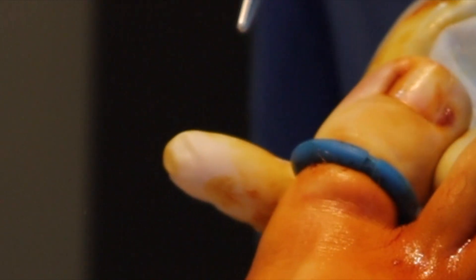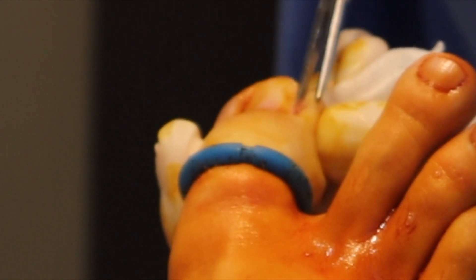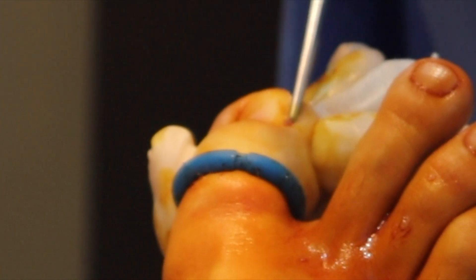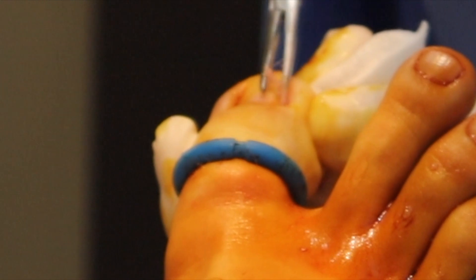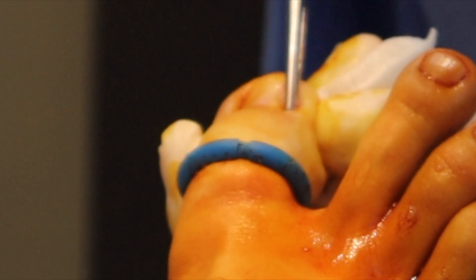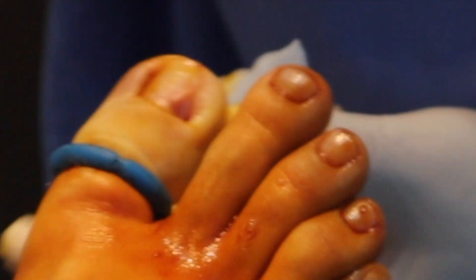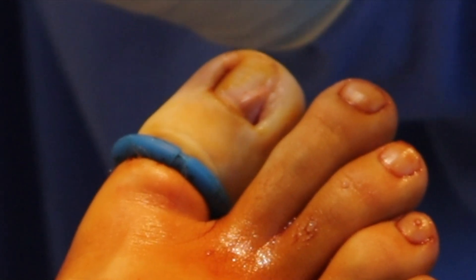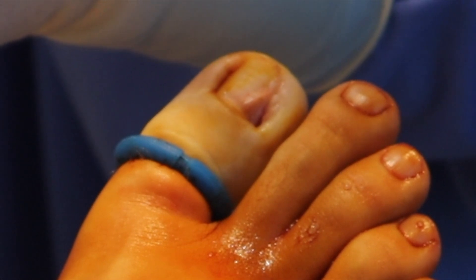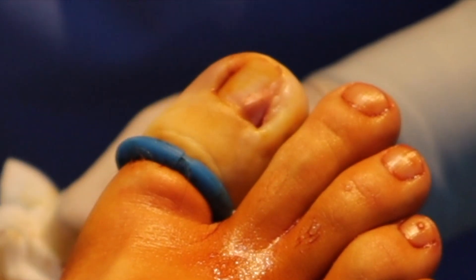Then I'm going to take a hemostat and get that piece out. Now we're not going to see a big piece today because I cut half of it away last week, so I'm sorry to disappoint — it won't be a majorly huge chunk. There we go. We can see that part was outside, and this is the part of the root, which is much thicker and wider. I'll leave that for my friend to see after.